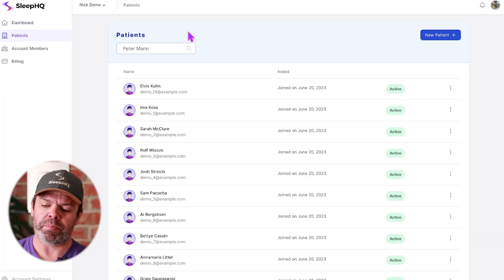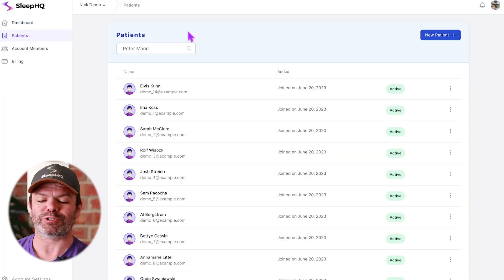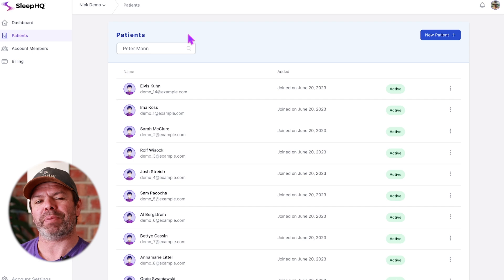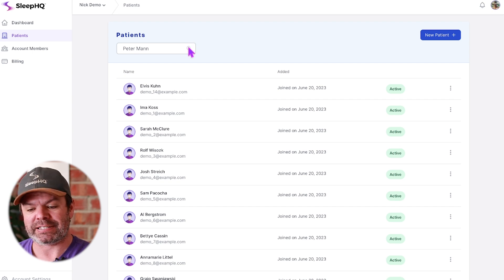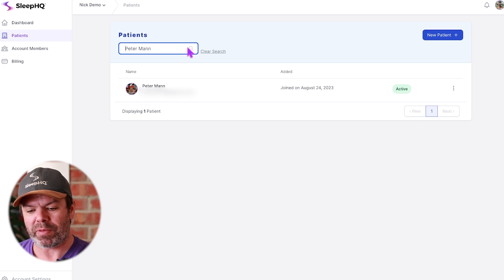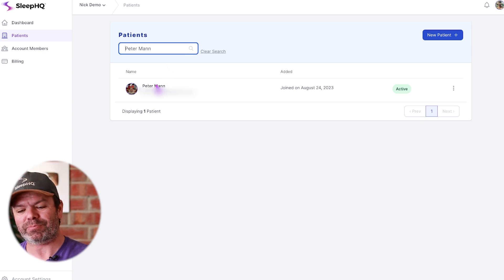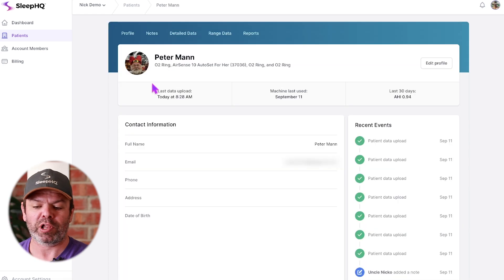I've got a bunch of demo patients here, but I've also got one real one, Peter Mann. G'day Peter, who's let me use his data today. We'll do a search for Peter Mann. He's called up the clinic, needs a little bit of help with his CPAP machine. Here he is, so I'll pull up Peter's profile.